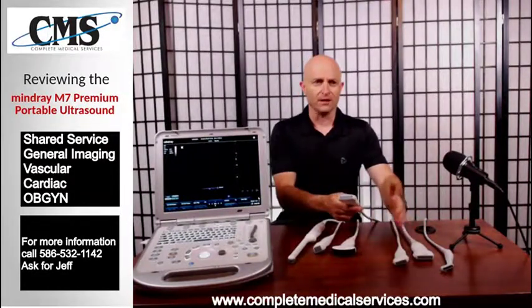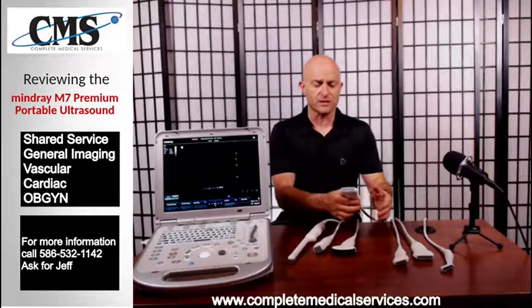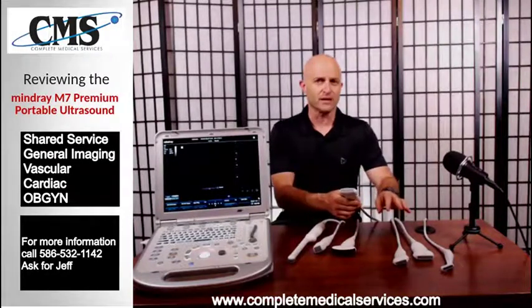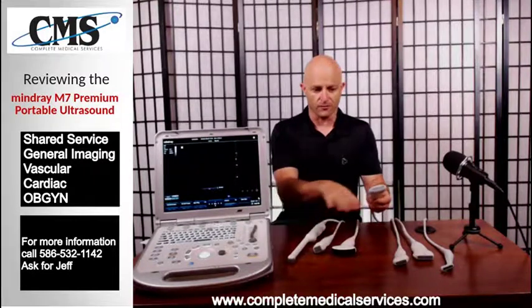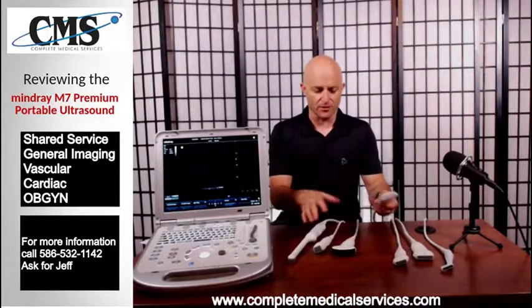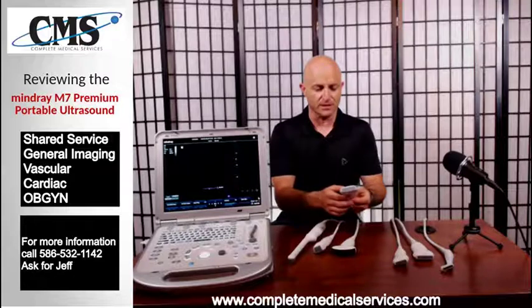Next we're going to go through a selection of linear transducers. These are the typical linears that people will choose from. There are other options for all of the different transducers that I'm presenting to you right now.